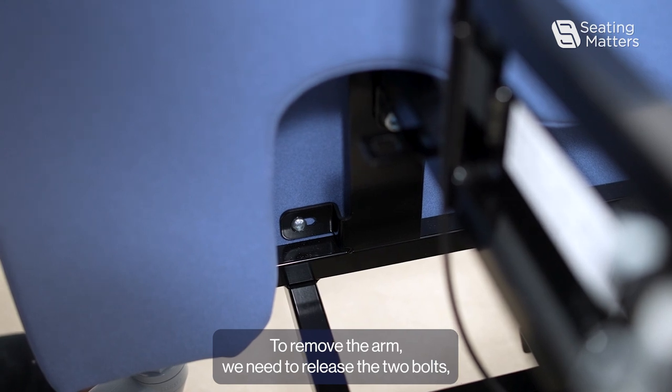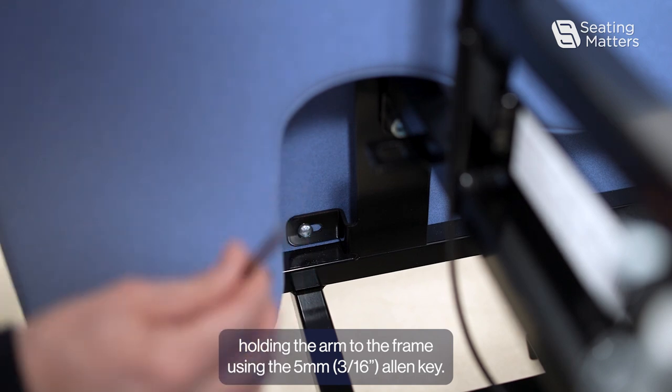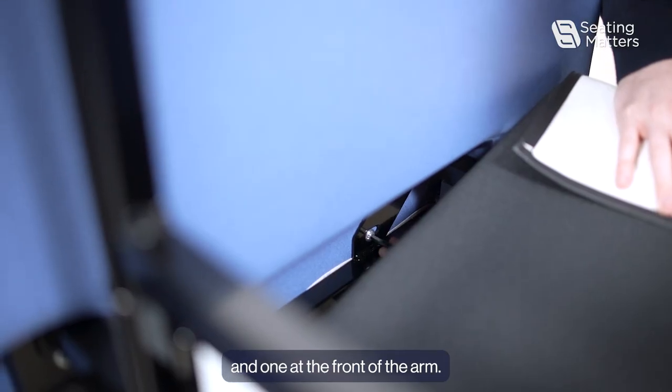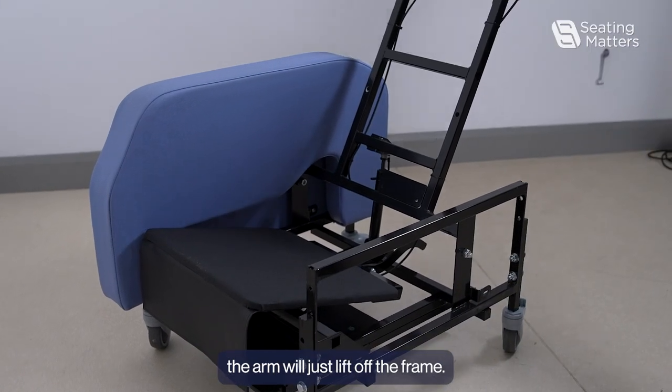To remove the arm, we need to release the two bolts holding the arm to the frame using the 5mm Allen key. One is located at the back of the arm and one at the front of the arm. Once you've released the two bolts, the arm will just lift off the frame.